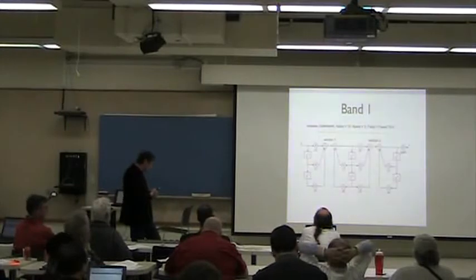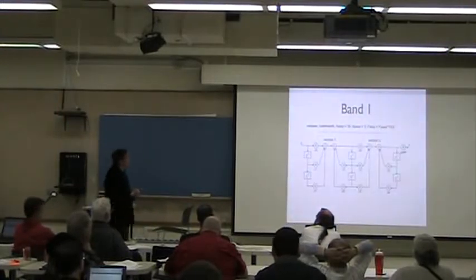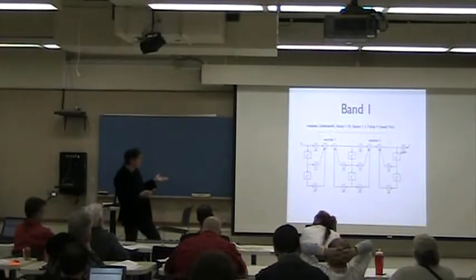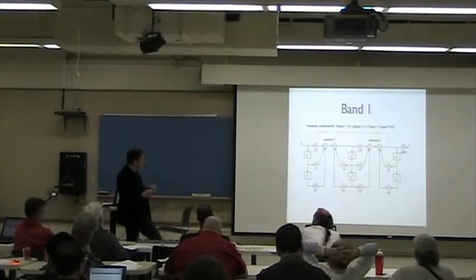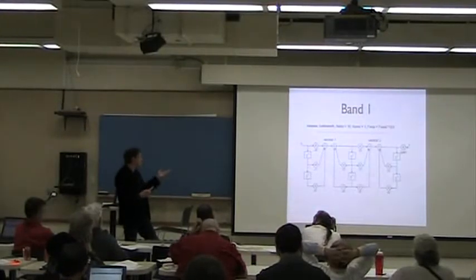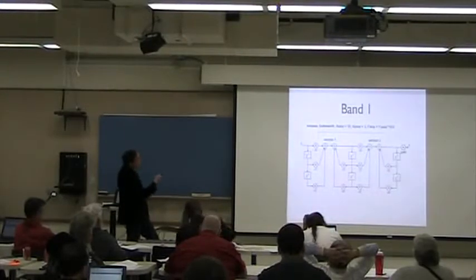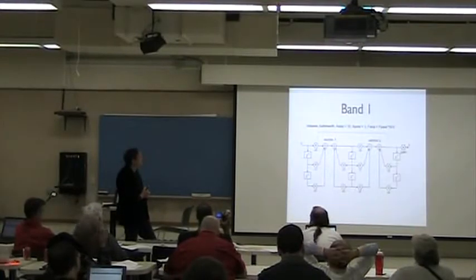And the thing is, it's pretty general purpose filtering. Right now we're using it for the hearing aid device, but in theory it could be used in all kinds of devices where filters are needed. So it's just a general purpose brick you can use to build different kinds of filters.